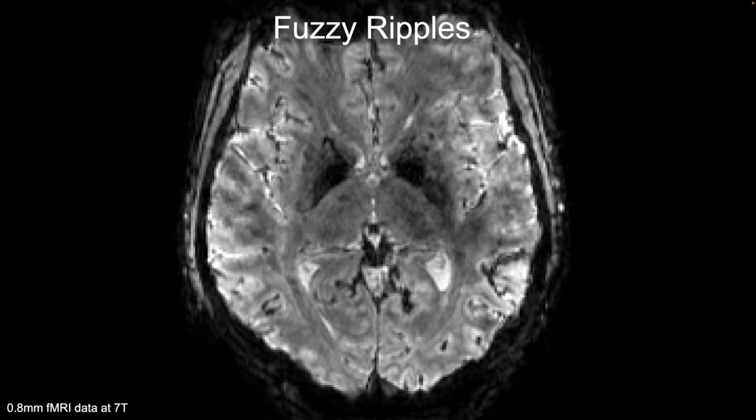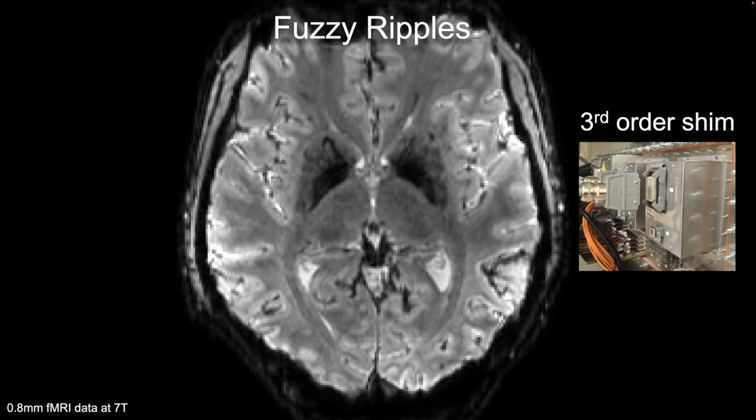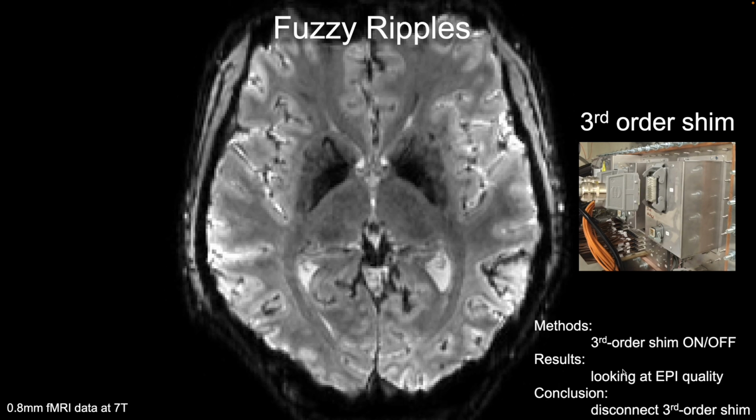They become clearer if I make them go away. So here, flipping back and forth, you see that those data that we are used to working with are actually quite corrupted by many, many things. And they can be improved much further. A very, very simple thing that I did here to improve the data quality was to unplug the third order shim, which has quite a significant effect. And that's the story of the abstract. Data improve if you unplug your third order shim. That's our method, results, conclusion.